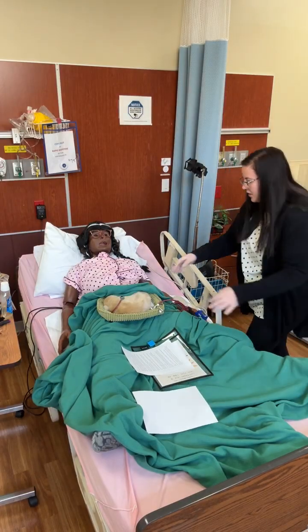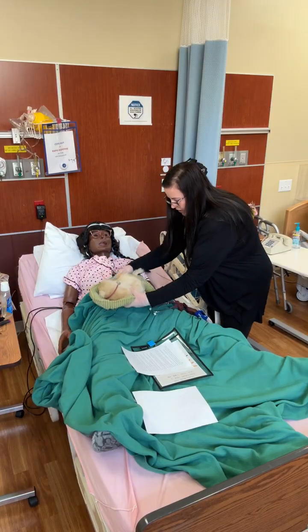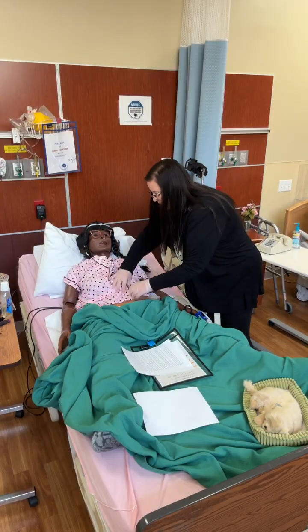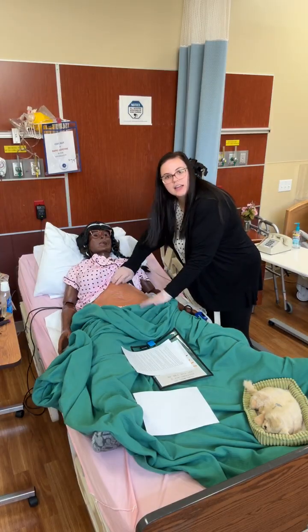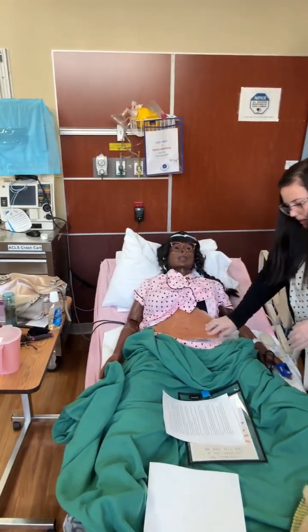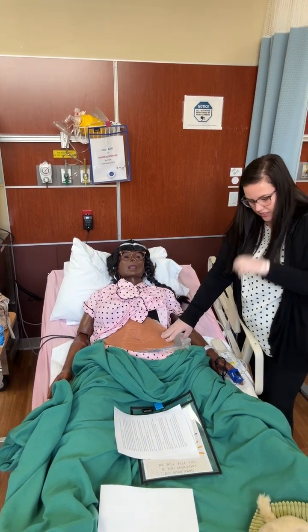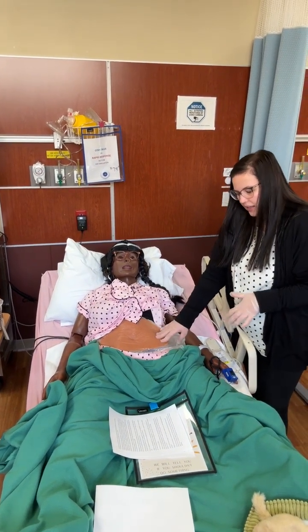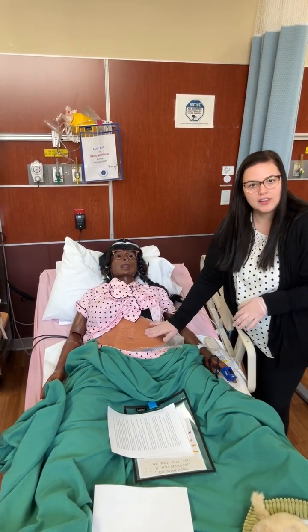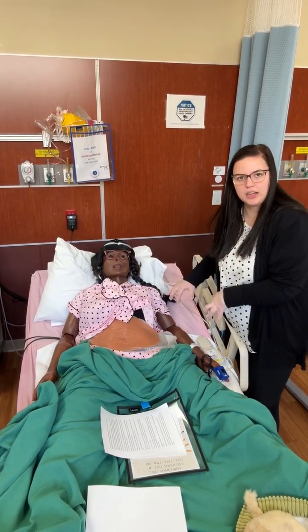This simulator for Carla is wearing a task trainer. So we're just going to move her personal stuff here. And you can see her task trainer here. This is an abdominal subcutaneous tissue task trainer so that you can practice sub-Q injections, and you will actually inject simulated insulin into this task trainer. You can use alcohol on this as well. So you can actually inject into here, you just cannot inject into the simulator herself.